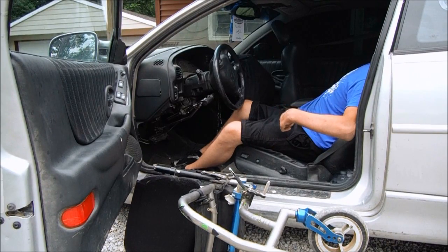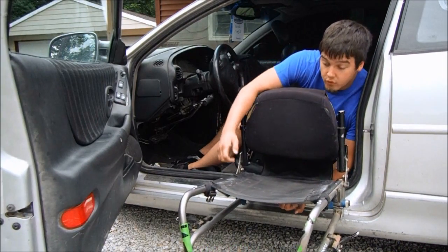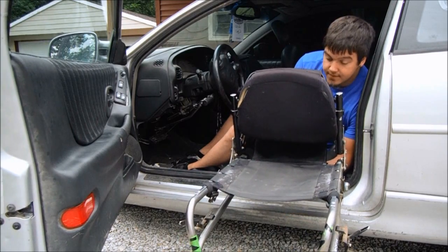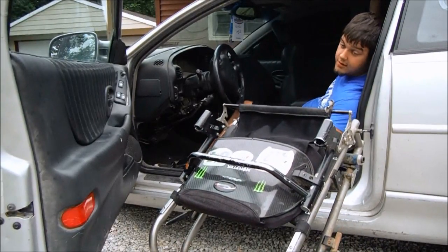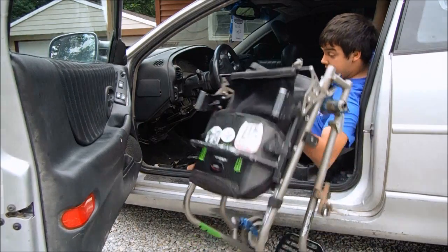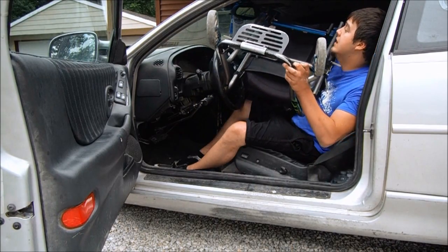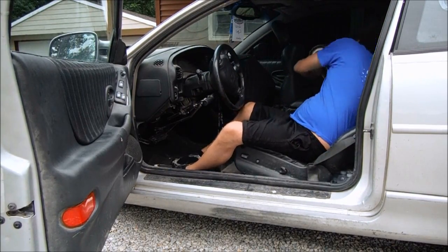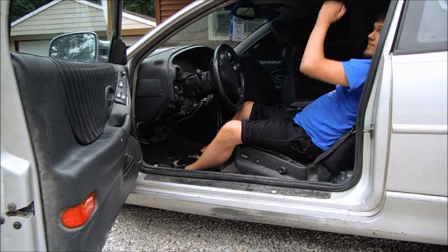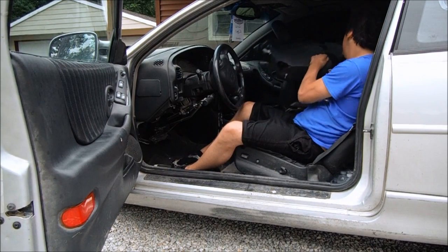I'll grab the frame — the chair doesn't fold together like a hospital chair, the back just folds down, that's it. I'll grab it, brace myself with my other hand, then take it, twist it, grab a hold of it, and make sure I'm not hitting anything or tearing up my car. Slide it around and set it behind the passenger seat in the rear, then throw my cushion over and set it there.